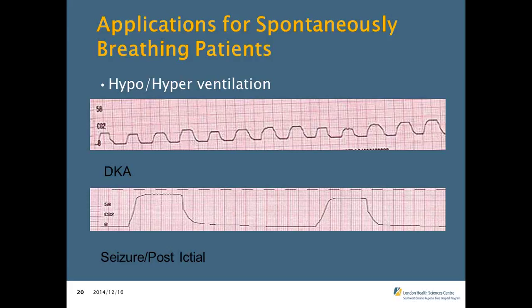I agree 100% there. Again, capnography is dynamic. It's going to change over time, even within the same disease process, depending on what's going on. So try not to get too hung up on it. Just use it as that piece of the puzzle and what's going on with your patient. Good. In the bottom example, this could be placed on a patient who's post-seizure, post-ictal. So you can see, I can look at that and say, well, they're not breathing very quickly and their EndTidal is high, so maybe we want to ventilate that patient. It's not quite adequate at that point as a piece of the puzzle of ongoing proper patient care.